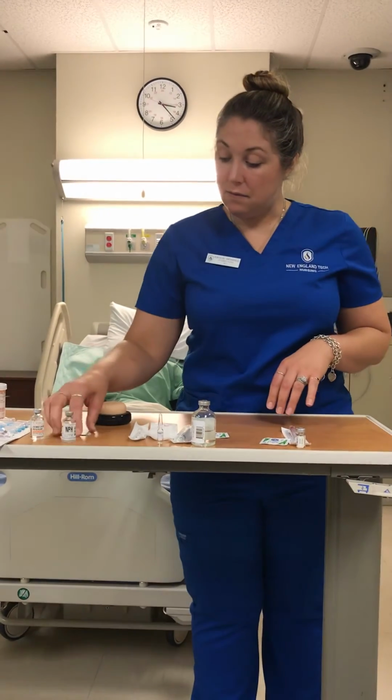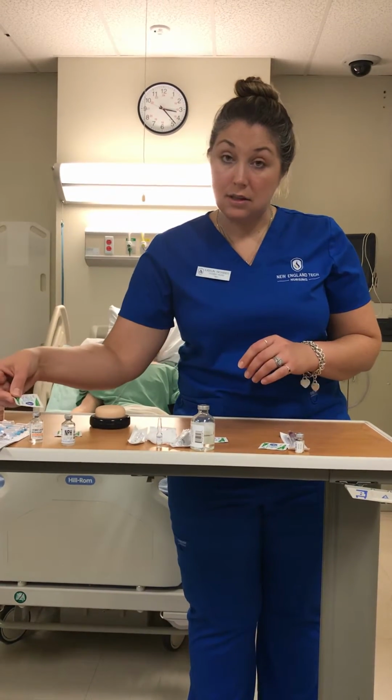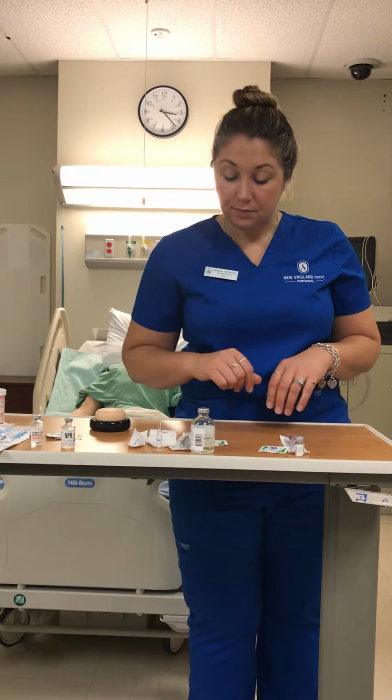Next we have, well, you also want to make sure that when you're doing that you use an alcohol pad to clean the tops of the vials.